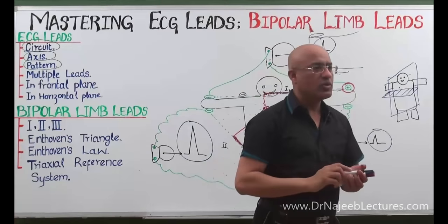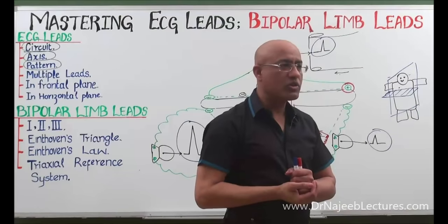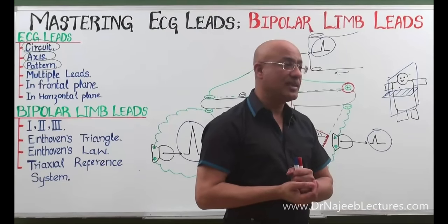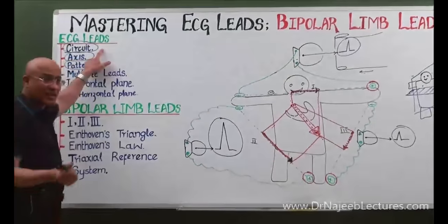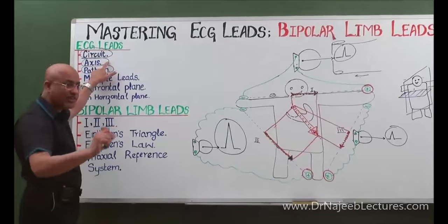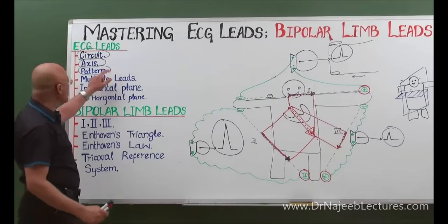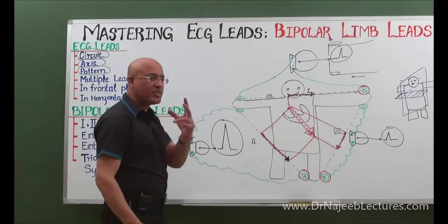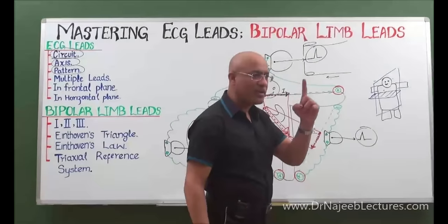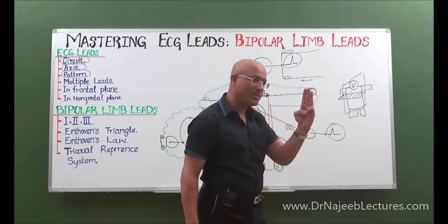Lead 1. So next time when you are studying the lead system, most students get confused because somewhere books talk about the circuit of the lead, at other points the axis of the lead, and still other points the pattern of the lead. Actually all of them are the lead. So next time when you think of an ECG lead, think of its circuit, its axis, and its pattern.